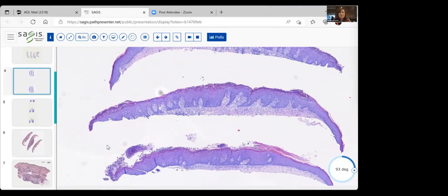I think the reason I find it very interesting is because at first you may not notice that there's anything unusual about the histiocytes in this condition. They're almost inconspicuous, because the first thing you see is a shave biopsy. This was probably taken from the groin in this case, and you have acanthosis, right? Acanthosis meaning thickening of the epidermis.